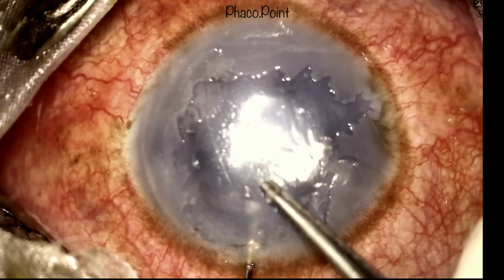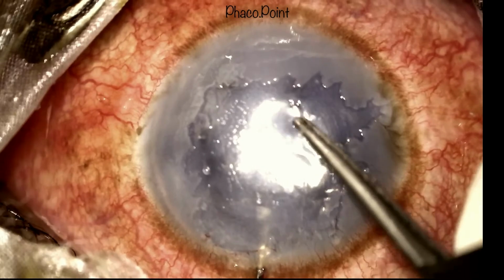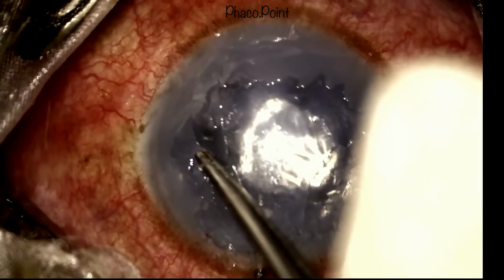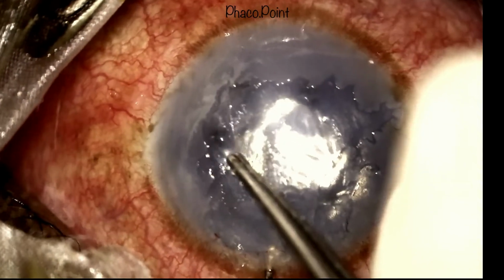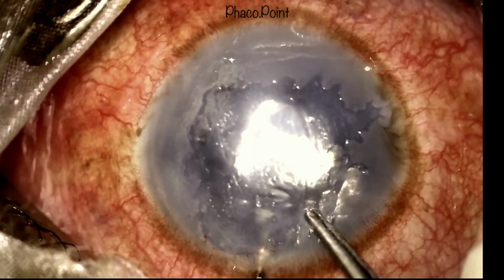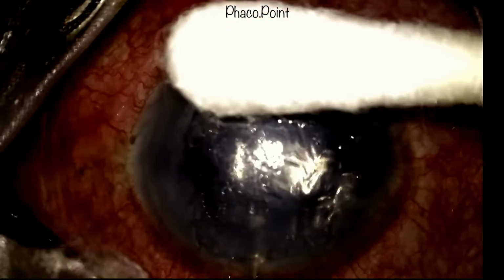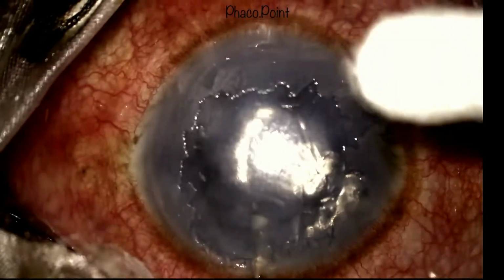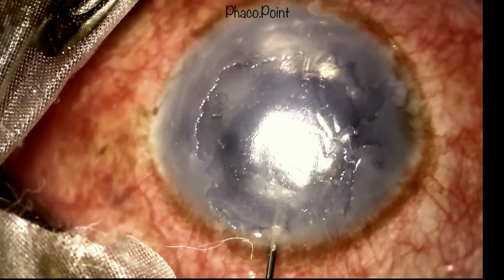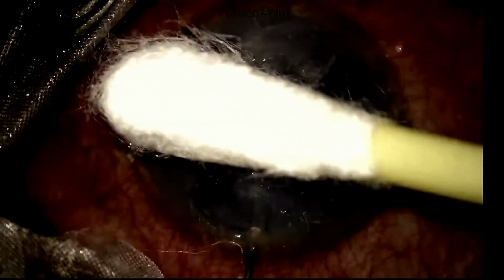Now, the two factors that make us believe that Descemet's is attached are, one, the cornea clears. You can see where we began and where we are now. And second, upon pressing on the venting incisions, you will not find any more fluid coming out through these incisions. Over a few more minutes, we found a further clearing of the cornea.